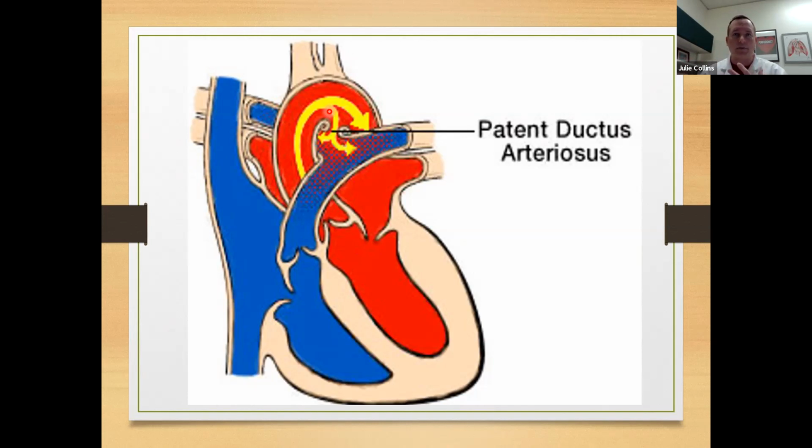Your body creates different angiogenesis pathways for collateral circulation. MAPCAs are collateral circulation to get more blood flow to your lungs. But when you go on bypass with a patient that has MAPCAs, again, your systemic flow can plummet because your flow is taking a path of least resistance through those shunts.